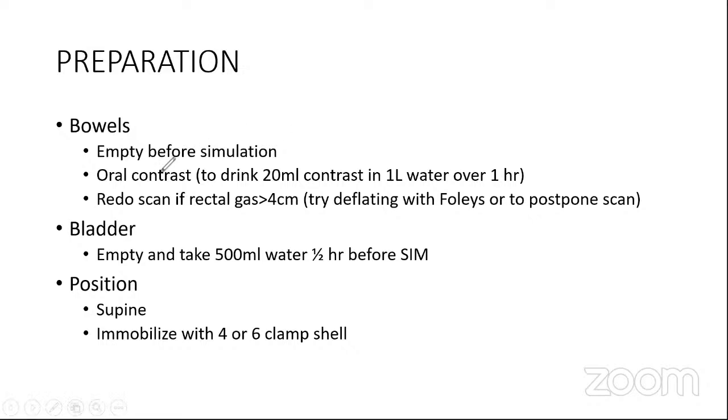Instead, we ask the patient to empty and bring the bladder down to its residual volume, and then ask the patient to drink half a liter of water, half an hour before the CT scan procedure. At a standard glomerular filtration rate, which we assume everyone to have, we would expect some amount of urine to collect in the bladder, and we expect that to be the same for the patient every time he comes for treatment.